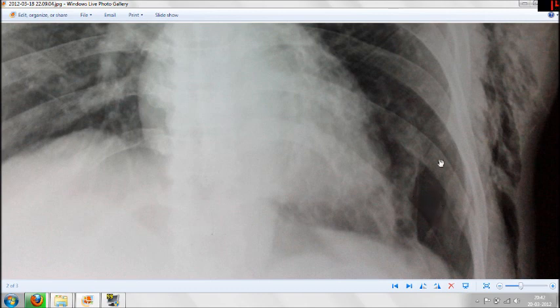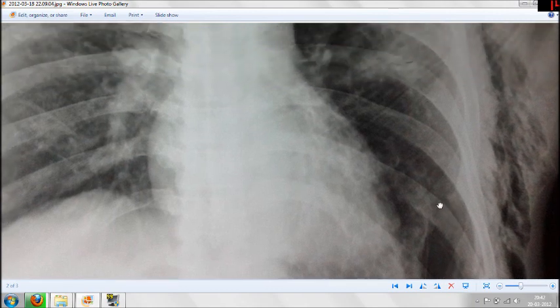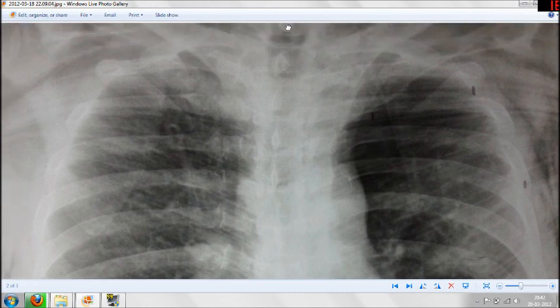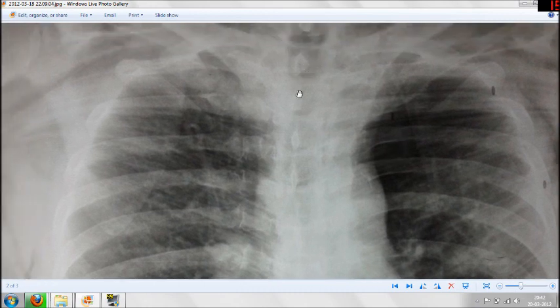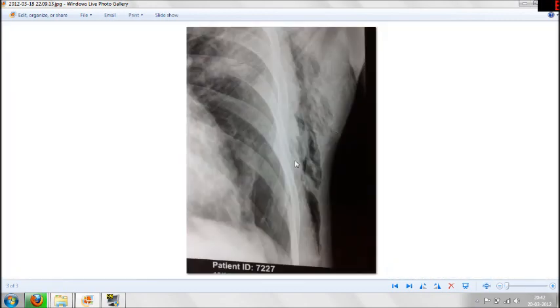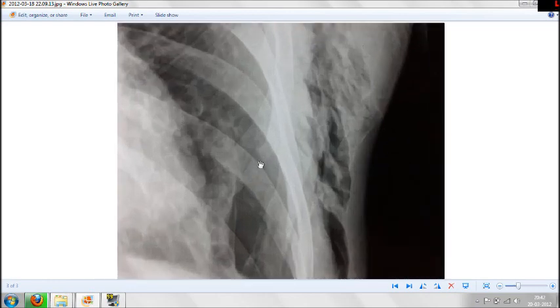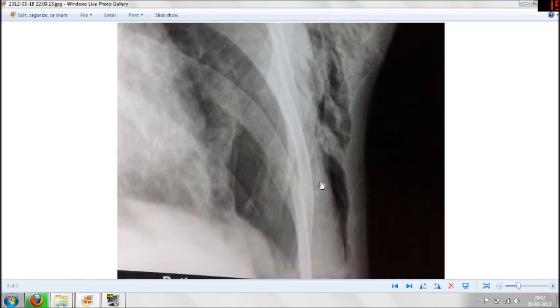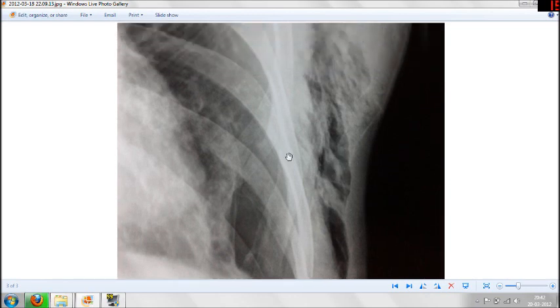In the lower fields also, you can see a total dark area which is filled with air without lung pattern. Along with shifting of the trachea to the right, you can also see surgical emphysema or subcutaneous emphysema in this X-ray.